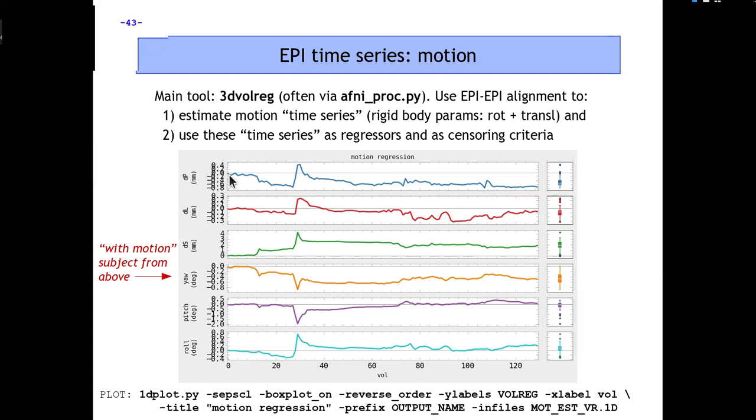And you can see that basically we're going to store the amount of change in anterior posterior translation all across time. So this axis is time. And so for time points where there was very little motion, any parameter, the change in it is kind of 0. What does it mean when we have this big change here? This is where there was a big change in position relatively. So wherever we see not necessarily a large value, but a large change in these values is where there was a large motion event.